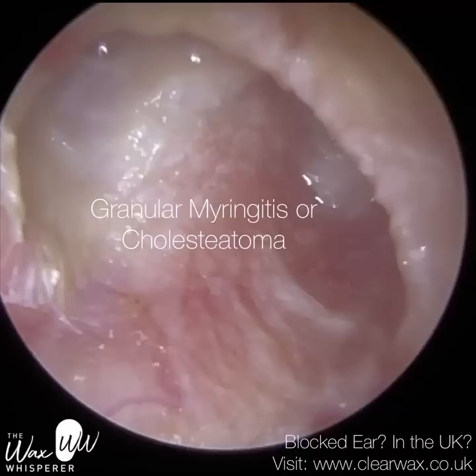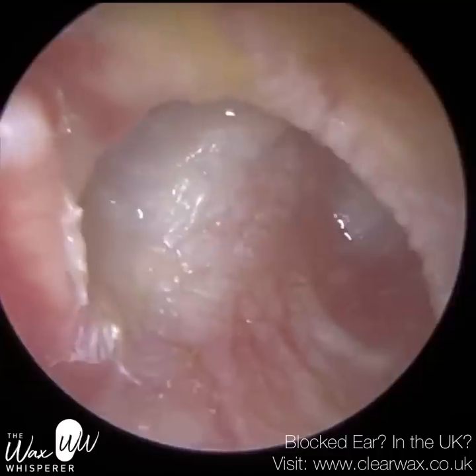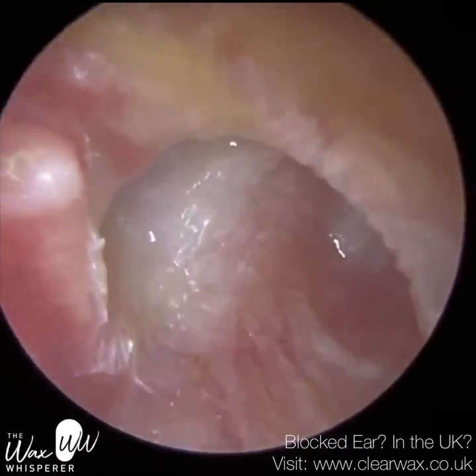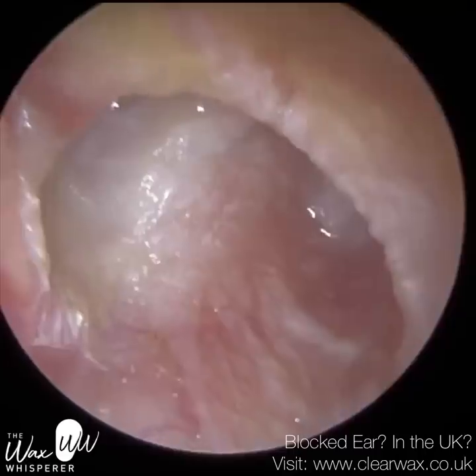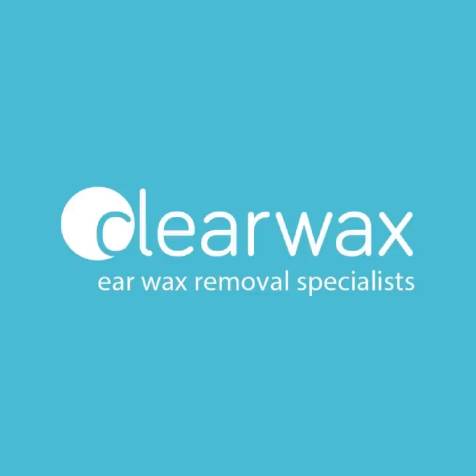Granular myringitis — myringitis is an inflammation of the eardrum's outer layer, an infection and inflammation. Granulation is new connective tissue that forms as part of the healing process; it can have its own blood supply and blood vessels, and has a bumpy, moist pink texture to it. I hope you enjoyed those interesting cases. I wish I could talk more about them in detail, but hopefully that all makes sense. Take care, speak soon.